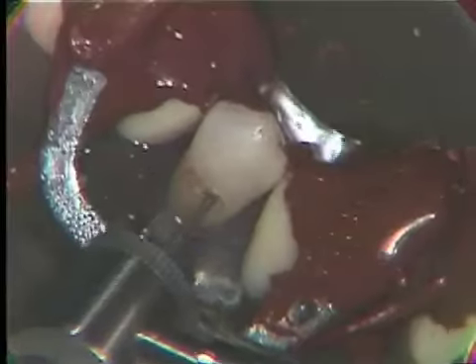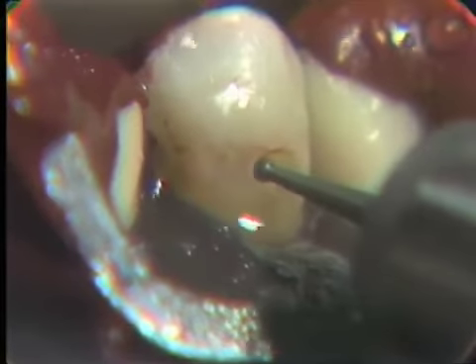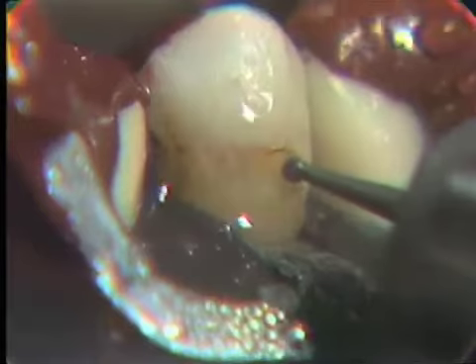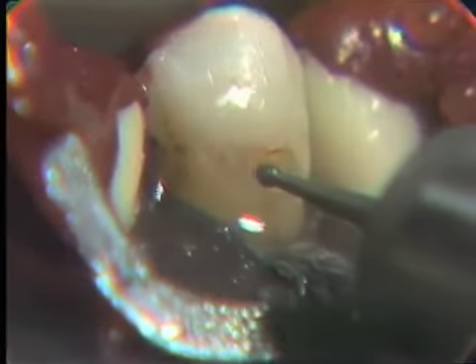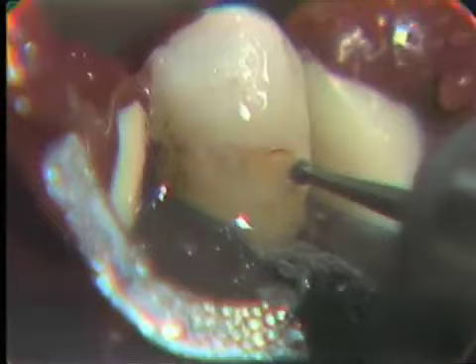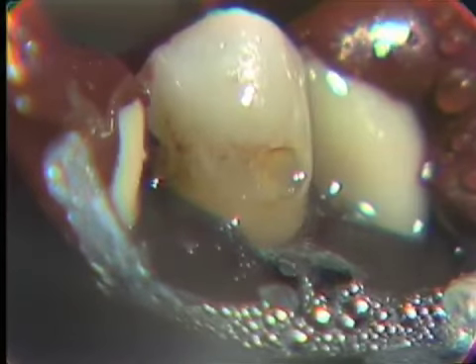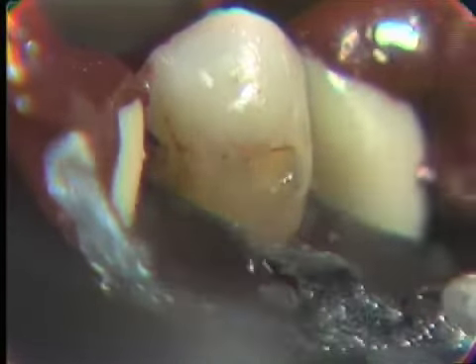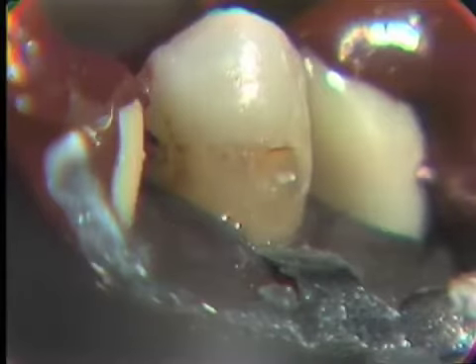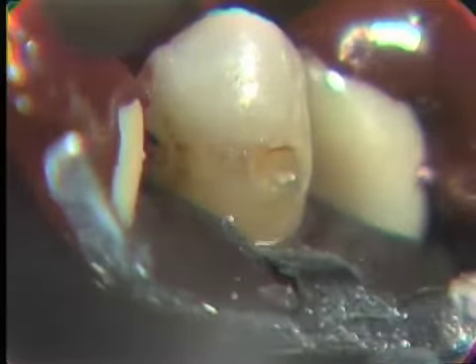Now, once we've opened our cavity preparation up and we've established an extension, we'll now go down to the 55 fissure bur for a more refined outline form. Now, in a clinic situation, you'll have the advantage of using your chip syringe, your 3-way syringe.